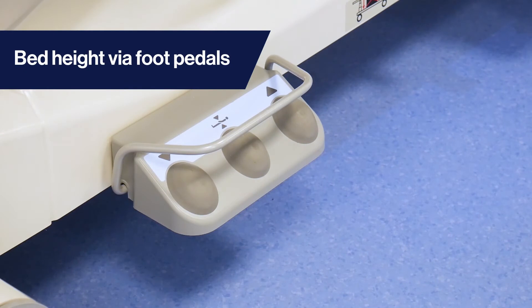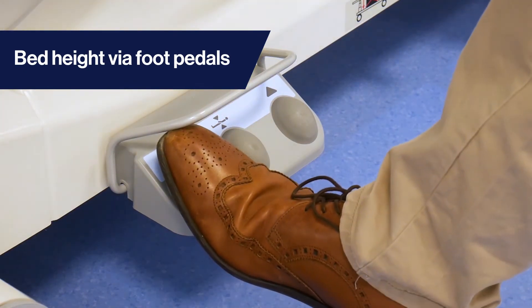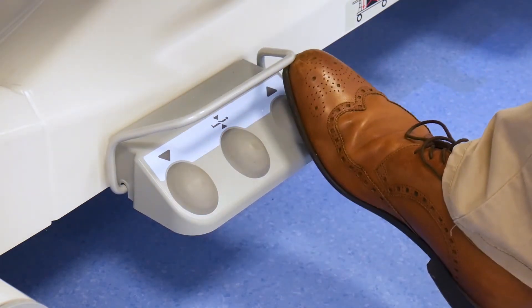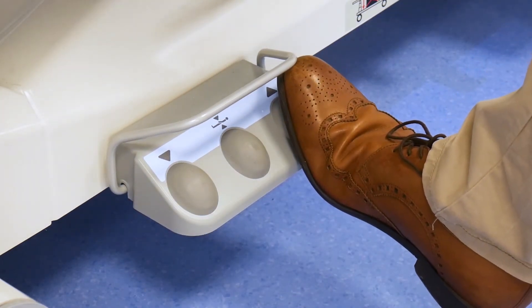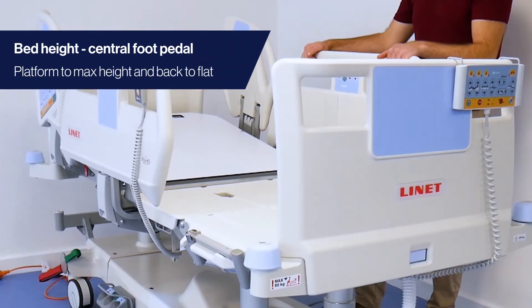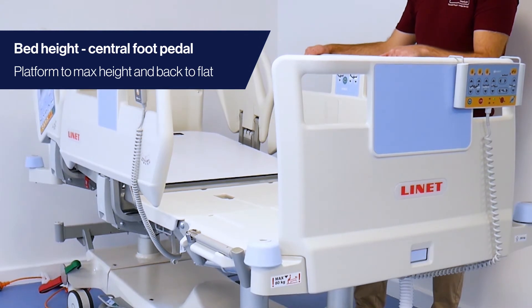Bed height can also be adjusted via unique foot pedals. Press the left pedal to lower the bed height. Press the right pedal to raise the bed height. The central pedal can be used to raise the bed to a maximum height whilst returning the platform back to flat.